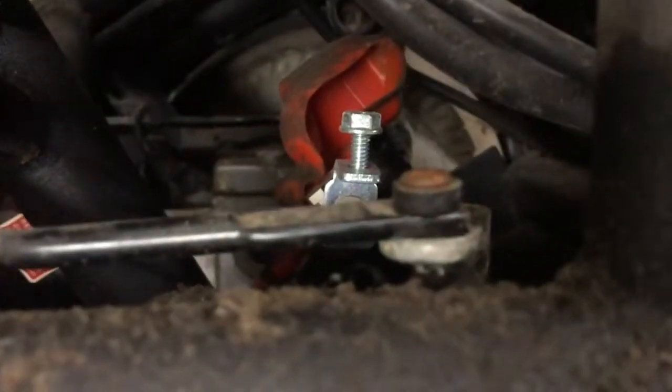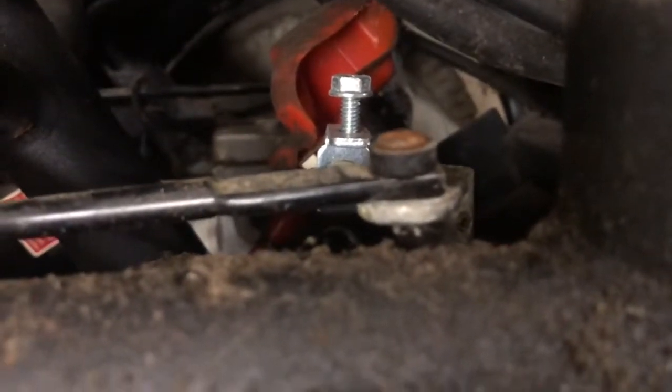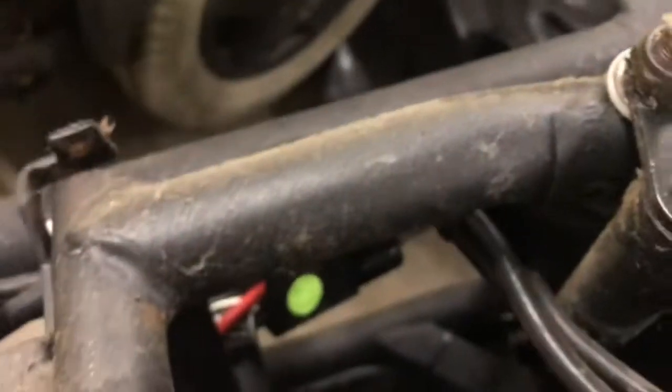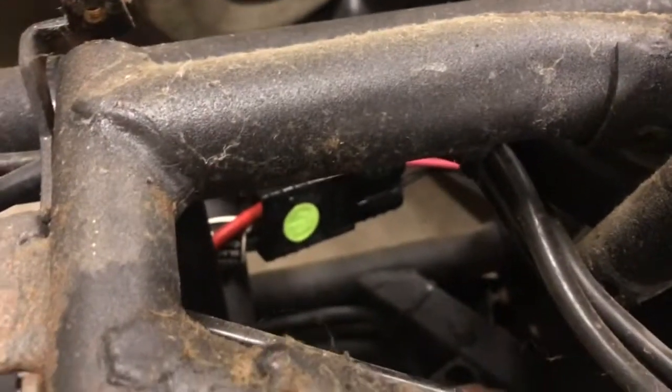Okay. Okay, let me move my hand here. See. There it is. You can just barely see it. So you can either get some pliers, needle nose pliers, or a flathead screwdriver and get it out. So let's go ahead and try that.